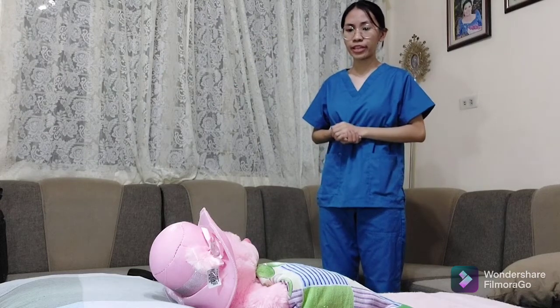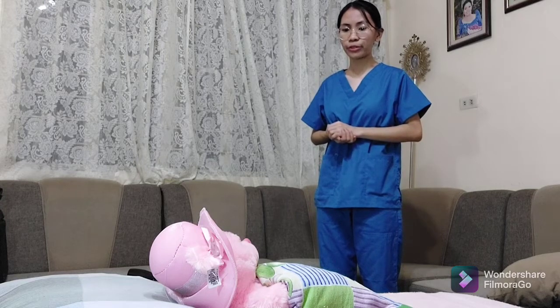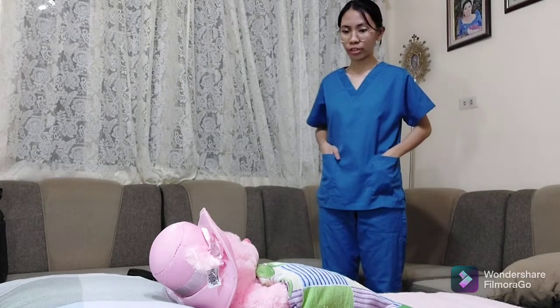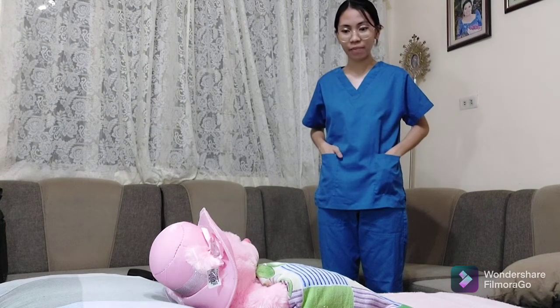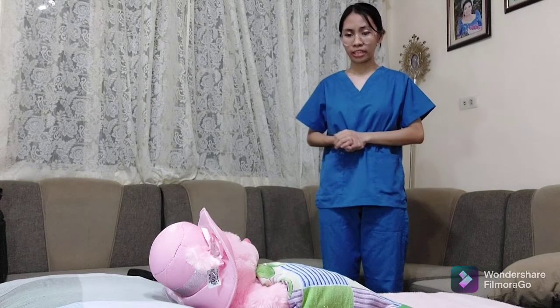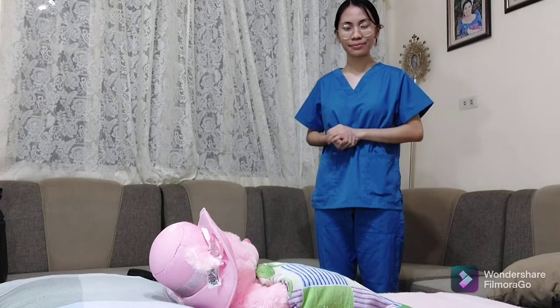Alright, ma'am, we understand that you are having difficulty urinating, and so your doctor, Dr. C, has ordered for you to have a urinary catheter. What I'm going to do is insert the tube through your urethra and into your bladder so that you can excrete your urine, okay? Later during the procedure, I'm going to expose your genital area and you might feel a little uncomfortable, but afterwards you should feel relief. Will that be alright? Do you have any questions or clarifications, ma'am?